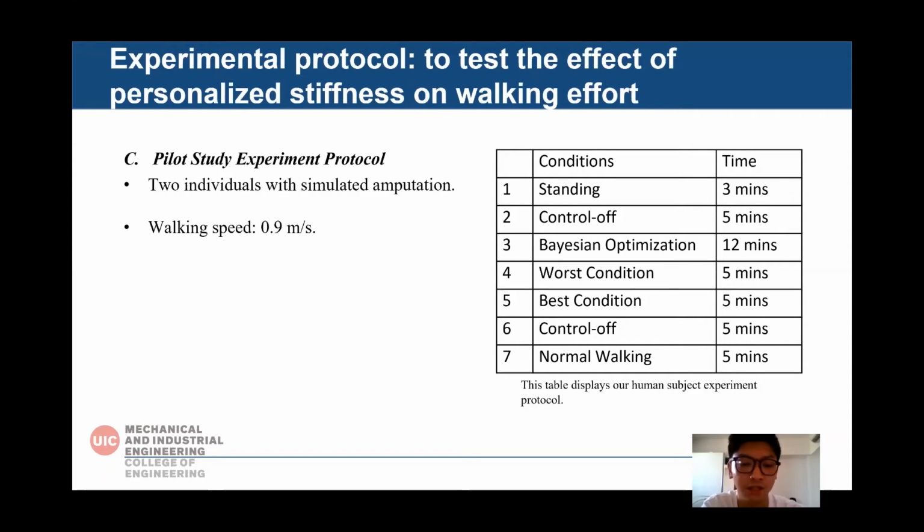The subjects had some break time, the same as their walking time, for recovery of breathing and heart rate. For example, they had 5 minutes break time after the best condition and 12 minutes break time after the optimization.